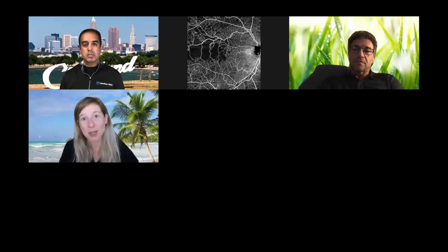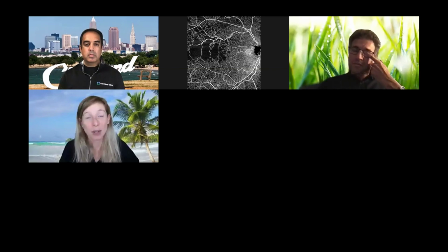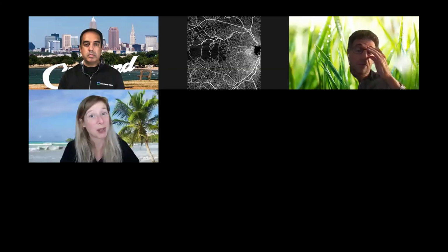Especially when it comes to OCT angiography, I think that's a great surrogate for fluorescein, especially as we're getting some more of these wide field OCTA. You can really pick up a lot of the peripheral lesions. I think it's really helpful in a lot of ways, but you can't bill for that on top of the OCT. And it does take more expertise from the staff. I think there's definitely a learning curve for the clinician. So even though it's a pretty specialized skill set and we use it a lot, unfortunately, we just can't bill for it really. Not yet, anyway.